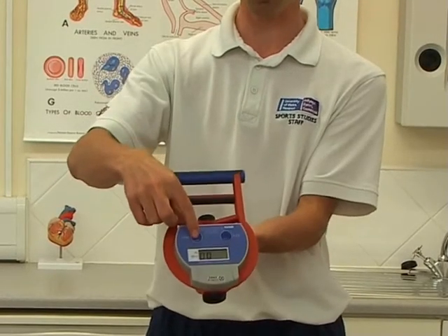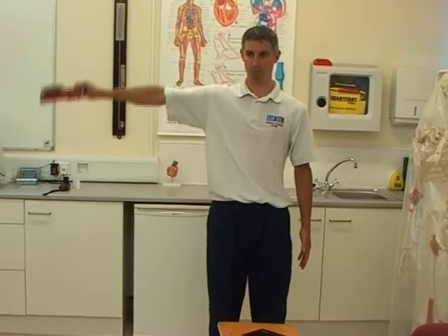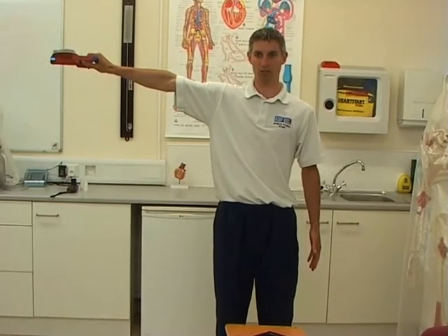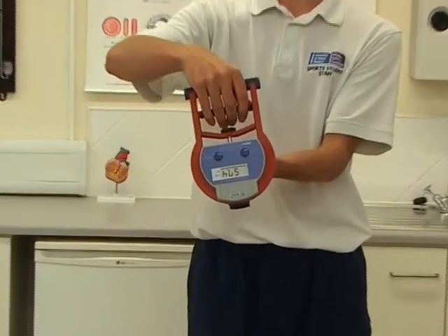Next, it's switched on using the on button, and it should read zero. Now position yourself in an anatomical standing position — feet shoulder width apart, arms down to your side, palms facing in. Next, raise your right arm horizontal, perpendicular to your body, and squeeze as hard as possible. Gently bring the unit down to your side, let go, and have a look at the reading: 57.4.